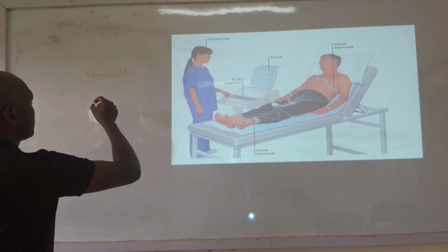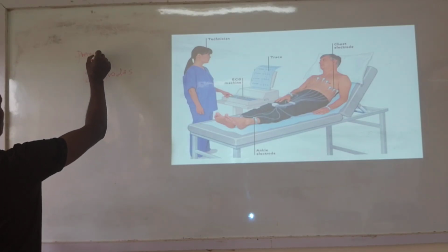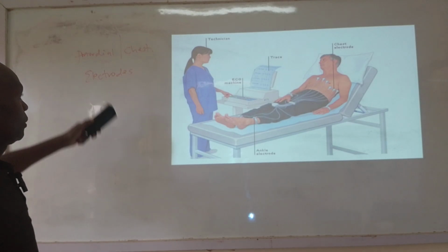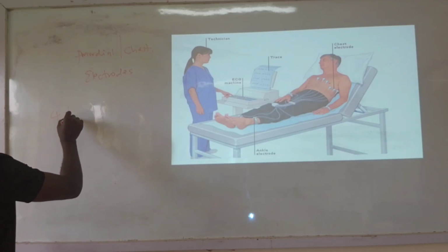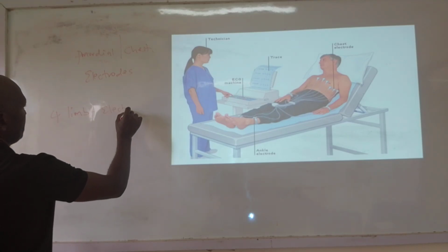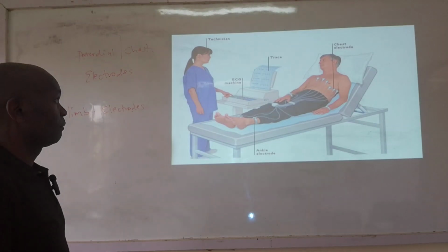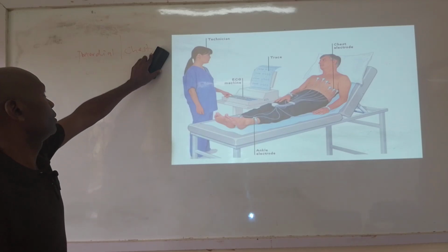And these electrodes are precordial, or chest. Remember, we said we have 6 precordial electrodes and 4 limb electrodes. So the patient is positioned that way, and the electrodes are placed in that order.